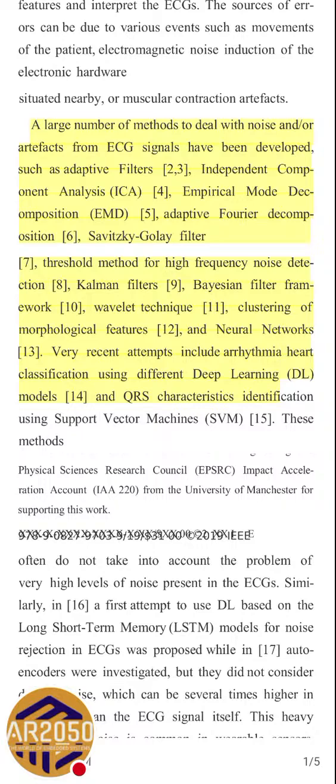If we are doing signal processing, we should be well aware of this filter as well. We need to really learn it, because it is used in many kinds of filtration. I'm not going into the details. Maybe I will create a detailed video about that.